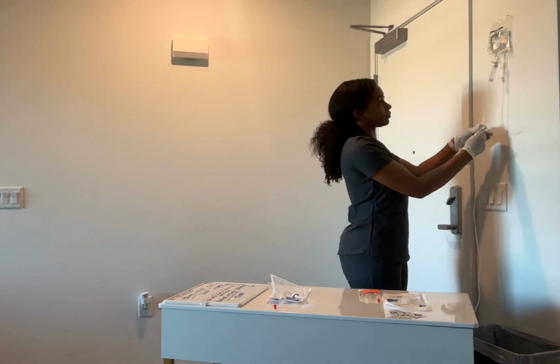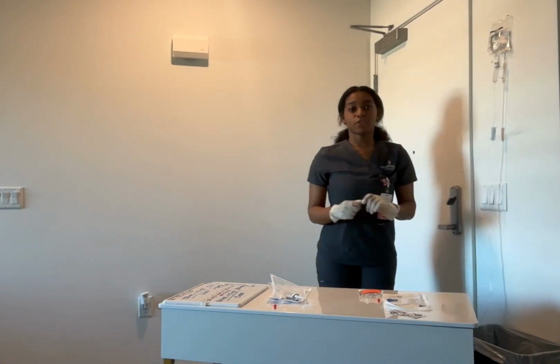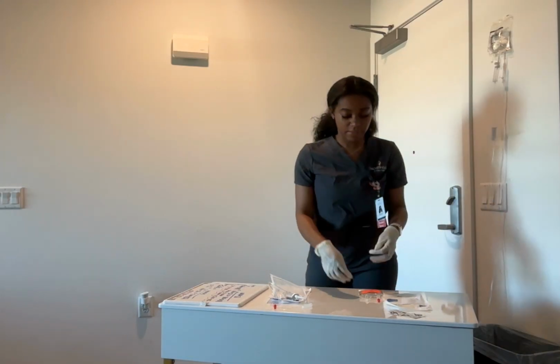Okay. Now that is done for a minute, so it is at 38 drops per minute.